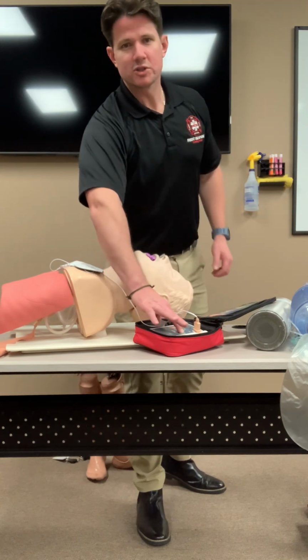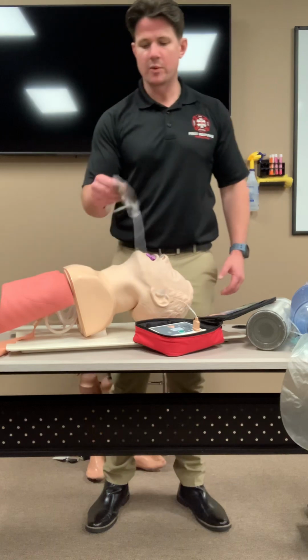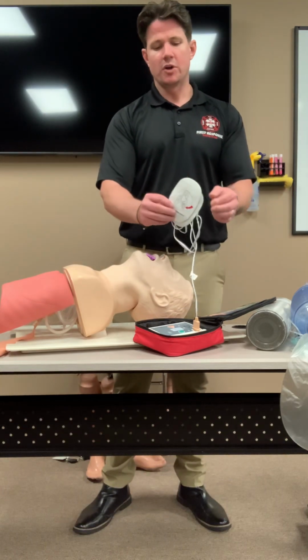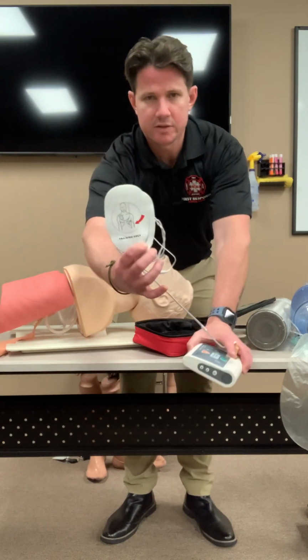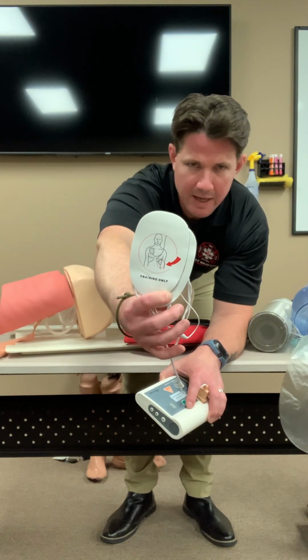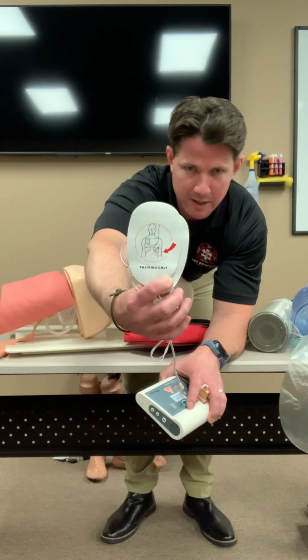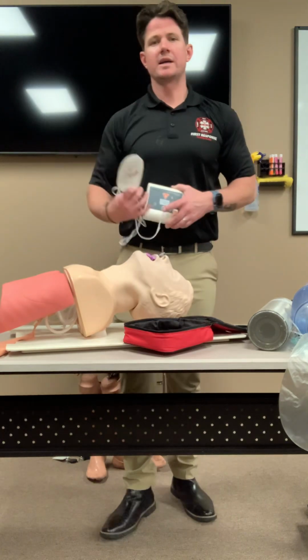So really, guys, once you've turned it on, it's pretty freaking easy. Follow the prompts, right? The big thing is, remember, you know where to put the pads, all right? And if you don't know, it's firefighter proof. Everything is written in pictures and colors. And as you can see right there, that shows you where to put the pad, right? That pad would go in the upper left on the pectoral, and then your other pad's gonna go up here.